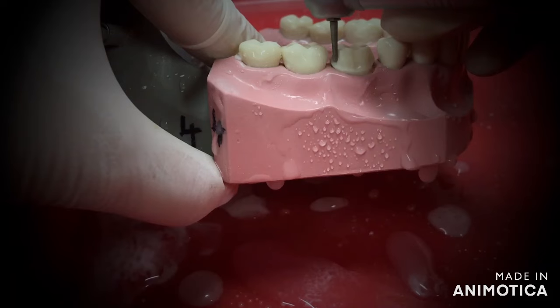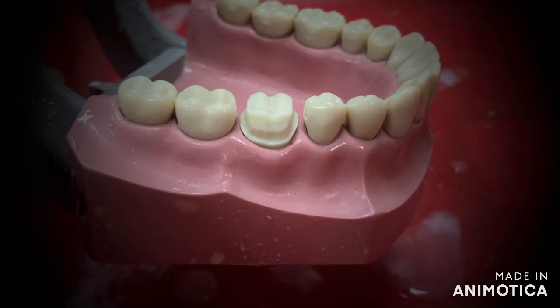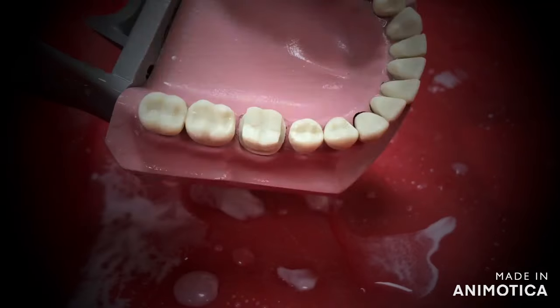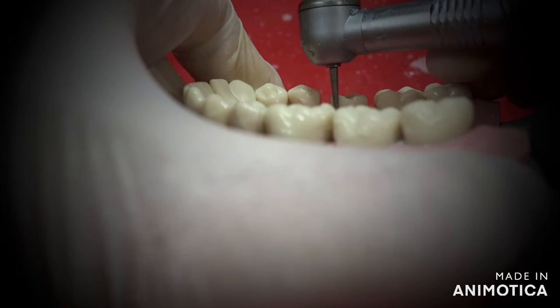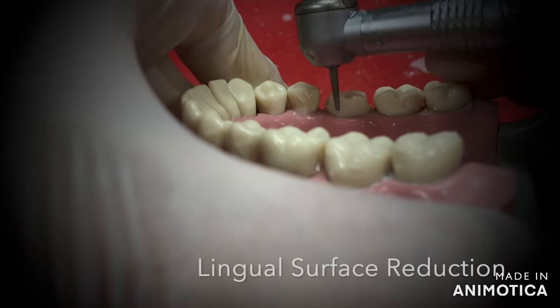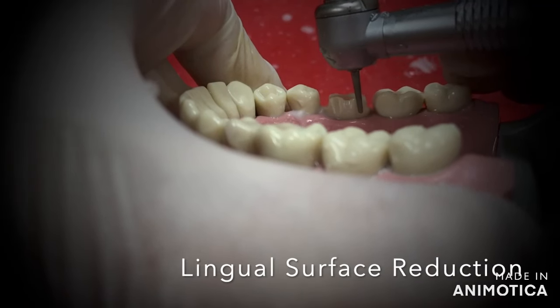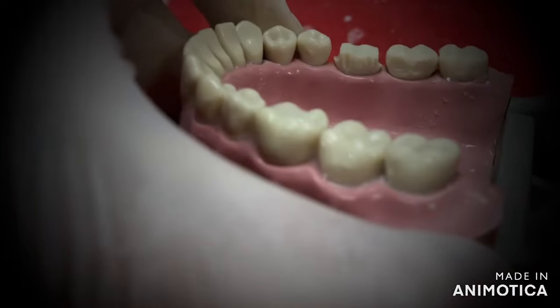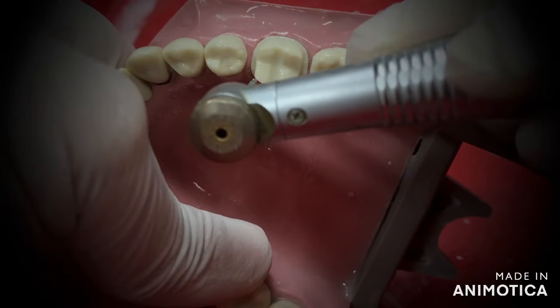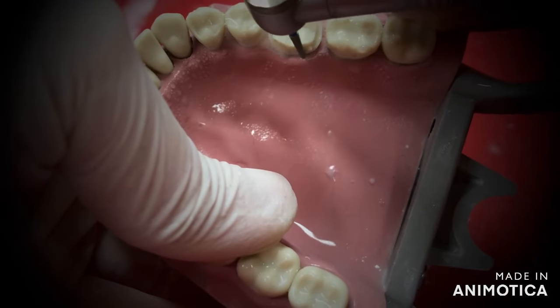Next we move to the lingual surface. Here you have to follow the same steps that you did on the buccal surface, except that this is only a single plane reduction. Make the three grooves, join the grooves keeping the burr parallel to the cervical part of the lingual surface, and run it from the mesial to distal surface, joining the proximal margin that you have already created. Make sure that you keep the burr straight and parallel to the tooth surface at all times — this way you ensure adequate taper and do not over-reduce the tooth. Make sure you do not tilt the burr towards or away from the tooth surface.